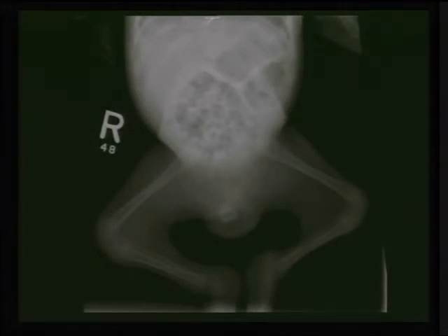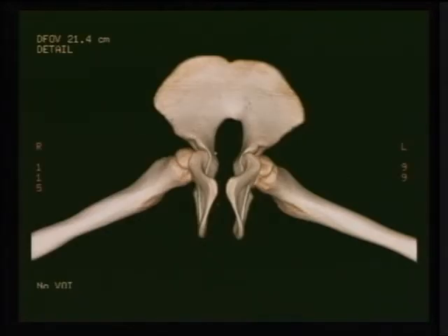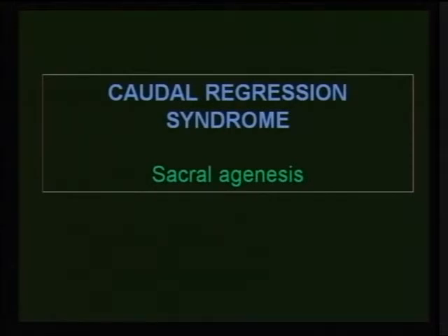If we are missing the lower lumbar vertebrae and we're missing the sacrum, what do we call it? We call it sacral agenesis or caudal regression syndrome, and this is also very specific. If we have a spine like this, hemivertebra, butterfly vertebra, fused vertebra, usually I don't describe every vertebra. This will take a long report. I say dysraphism, meaning the fusion between the ossification centers of the vertebra is missing, and that's what we have, dysraphism of these vertebrae.